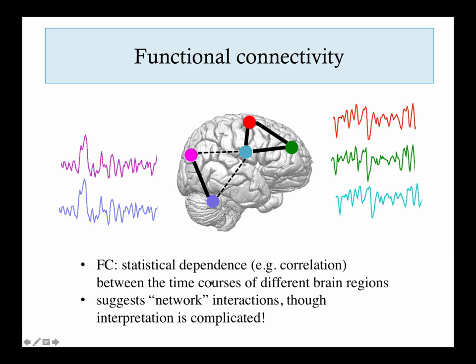But something that we have to keep in mind here is that this functional connectivity analysis is only looking at statistical similarities in these time series. We're not directly looking at the physical structural connectivity, and we're not actually even directly testing that these areas are interacting. So we just have to bear in mind that the interpretation is not that straightforward.